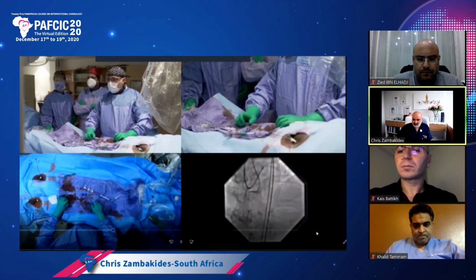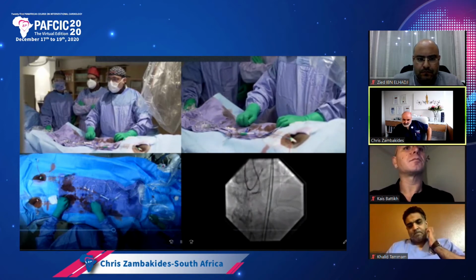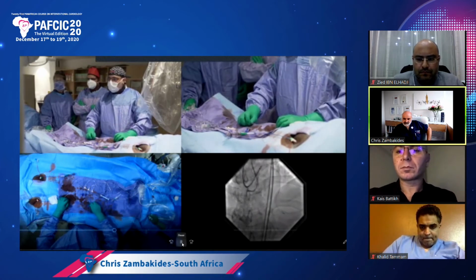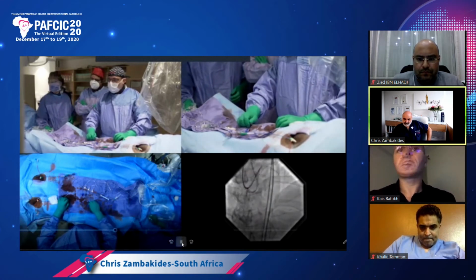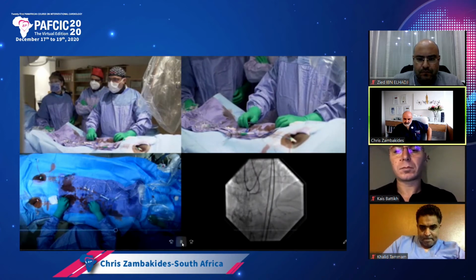Yeah, so you can see. Okay, so actually this new Corsair Pro XS is going very nicely. I'm able to torque it, and it's following the vessel. It does worry me a bit, the angle at the bottom. If I do push too hard, where is that going to go?